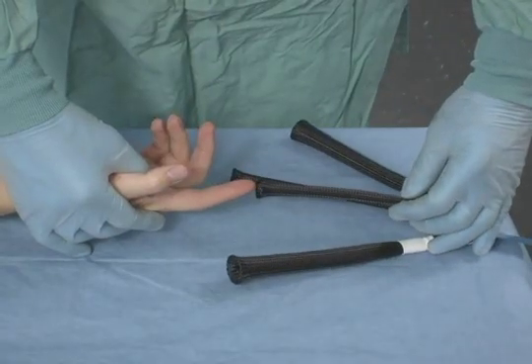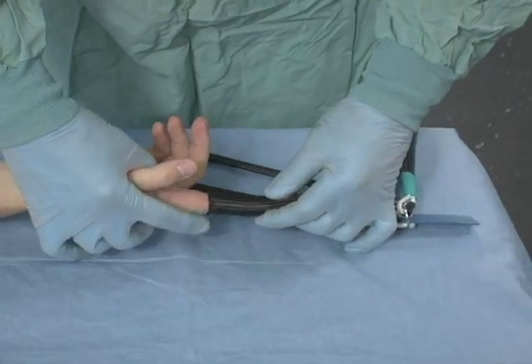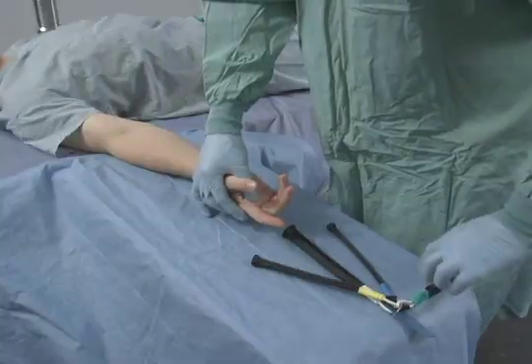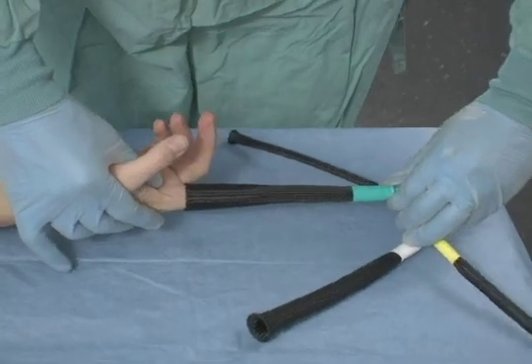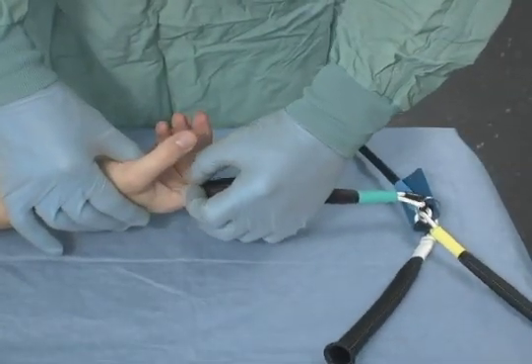The non-sterile finger trap sizing ring is used to determine the size of finger traps needed. The surgeon must check the size of both fingers that he will be using and choose the wrist stabilisation kit that has the appropriate finger traps. The finger traps are designed to fit over the second knuckle. The appropriate finger trap must fit over that knuckle and not slip when firmly pulled.